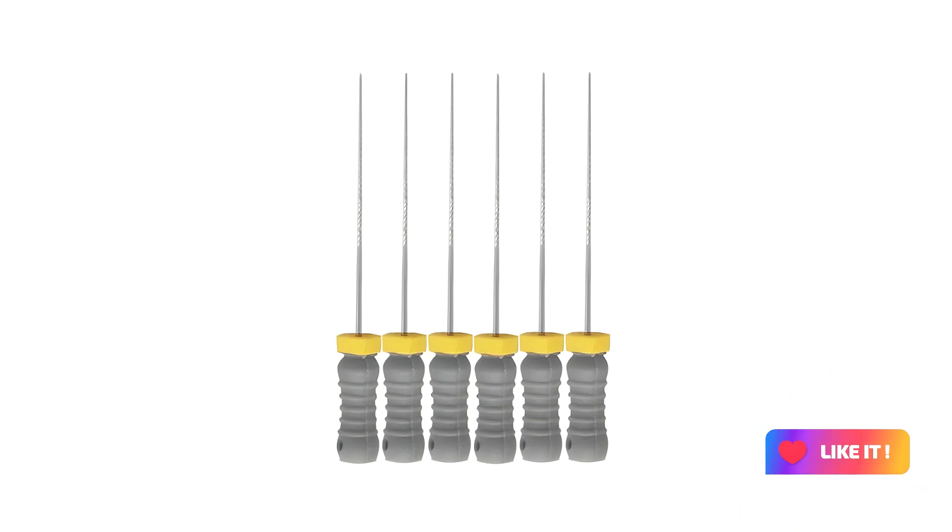After that procedure, insert your number 8 K-files — new K8 files — and pre-curve them, either at the end or just at the tip. Whenever you are entering into the canal and find any obstruction, don't try to force through it. Take out your file, curve it at the tip with your nail a little bit, then reassert it with a watch-winding motion. Suddenly you will feel a jerk — a sudden entry point into the canal — which will take you up to the full canal length.